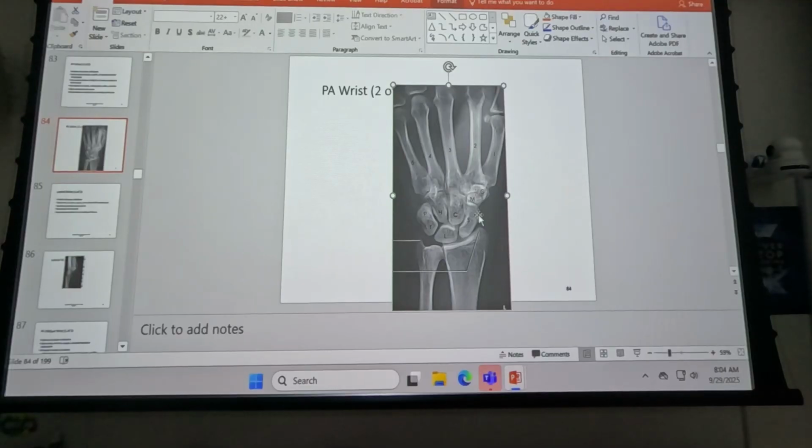Most of your fractures at the scaphoid are going to be pretty subtle, so the angulation could close that fracture and you can't see it very well. And also you've got some superimposition between the capitate and metacarpal here. So you just can't see the whole thing real well, right?